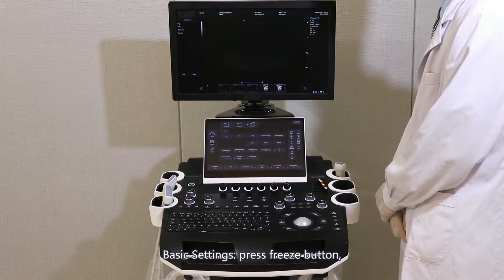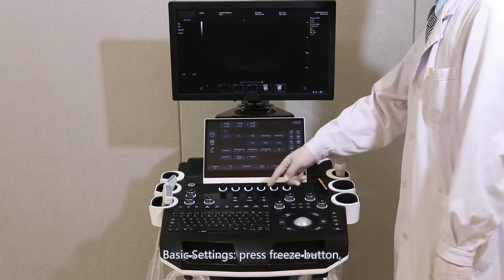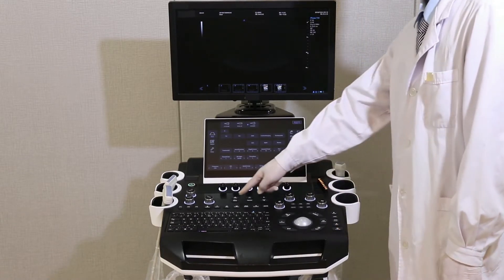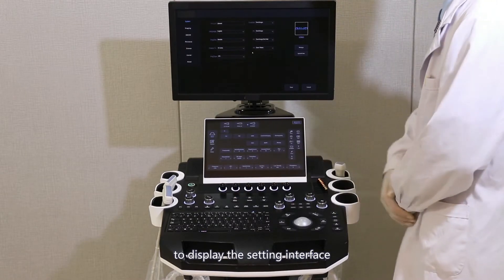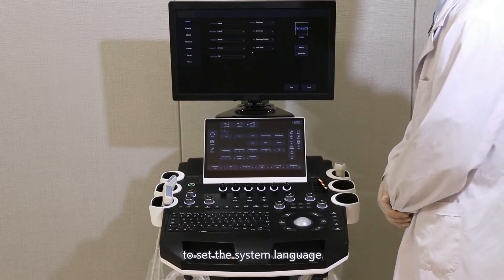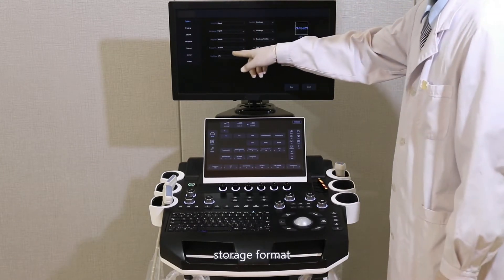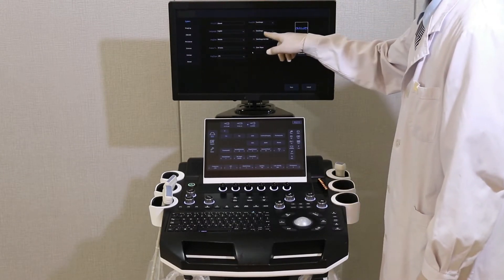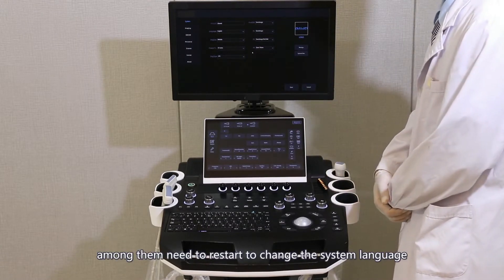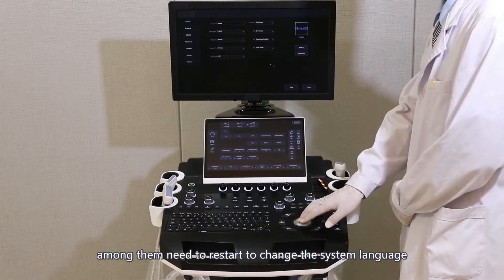Basic settings: press the Freeze button, then press the Setup button to display the setting interface for setting the system language, hospital name, storage format, storage path, and so on. Note that a restart is required to change the system language successfully.